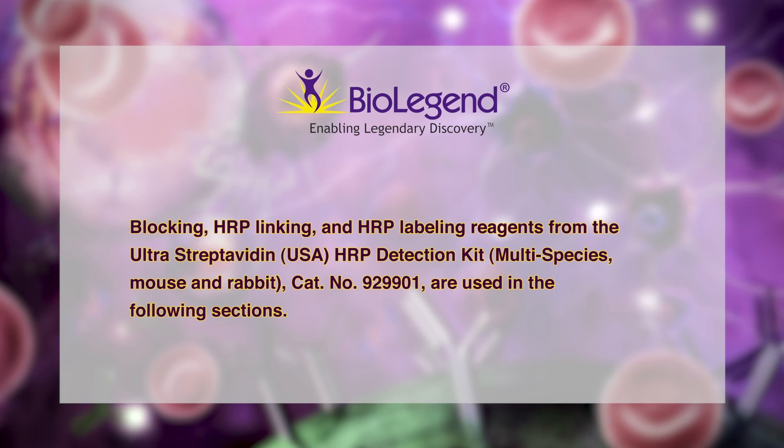Blocking, HRP linking, and HRP labeling reagents from the Ultrastreptavidin HRP detection kit are used in the following sections.